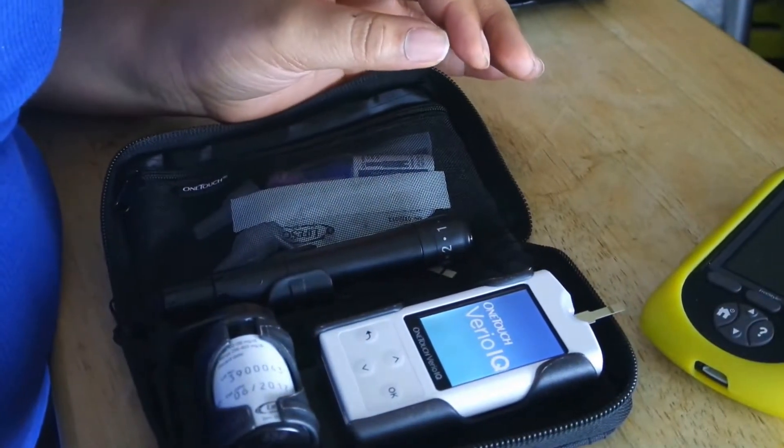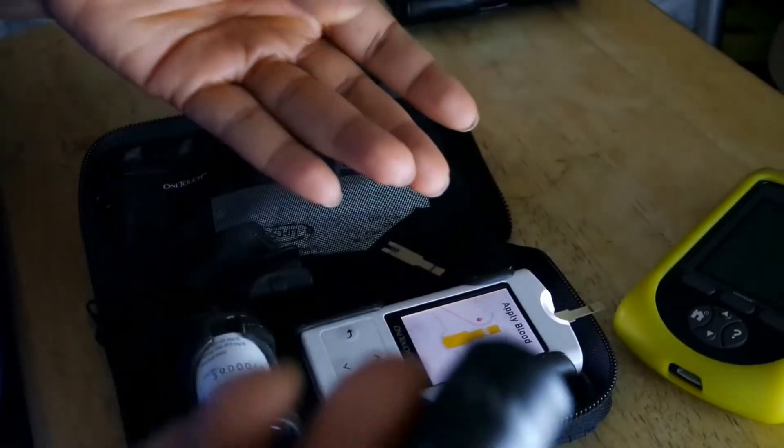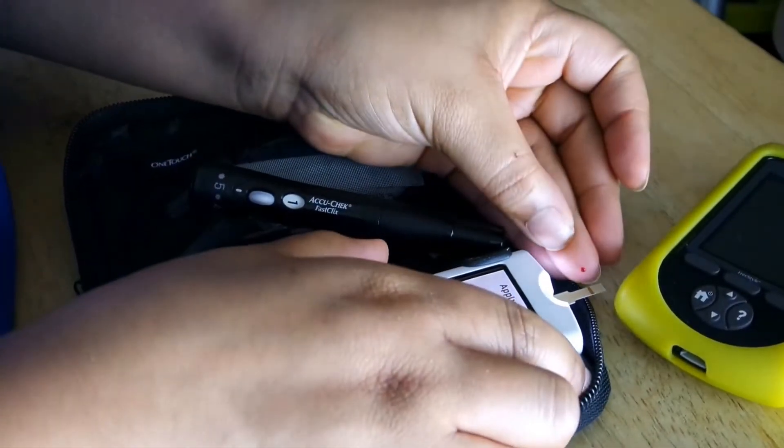Then I take my lancet device, poke my finger, and they say to clear the first drop of blood, so I do that. Then add enough blood to the test strip.